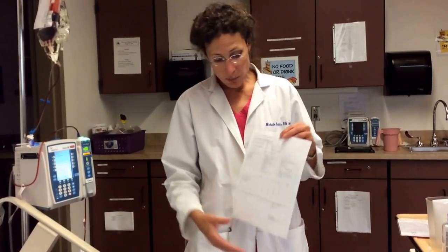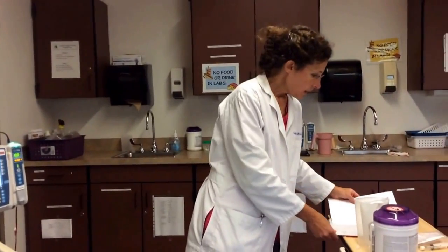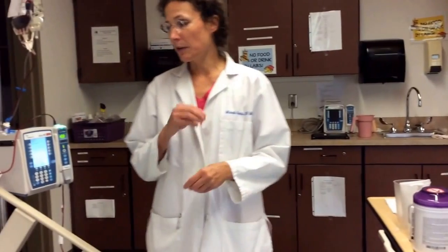In a pediatric population, or in some adults, when you're unable to initiate an IV larger, a 22 would be just fine, even a 24 in a pediatric patient as necessary.